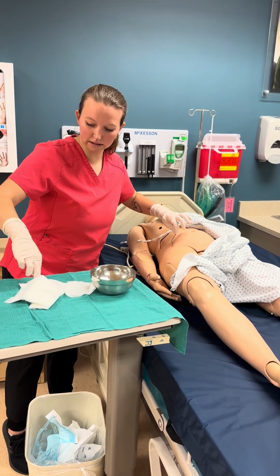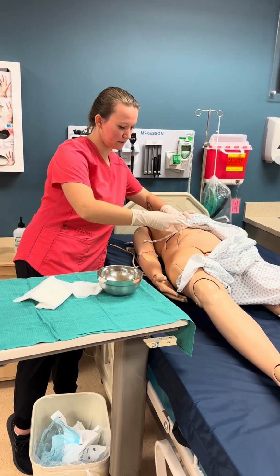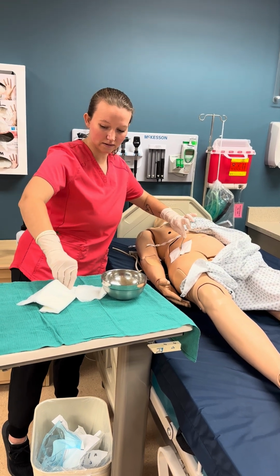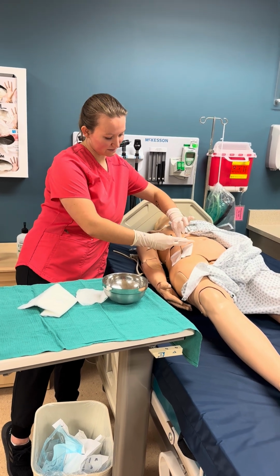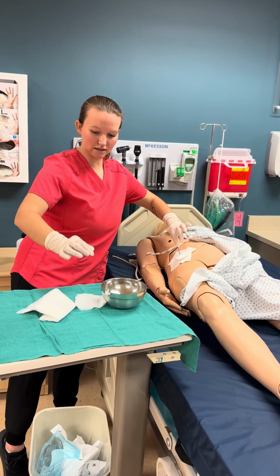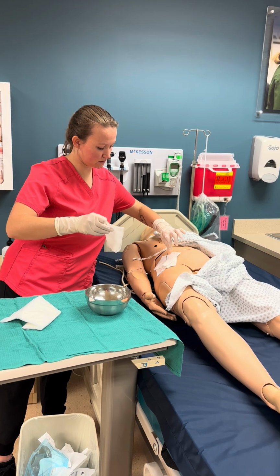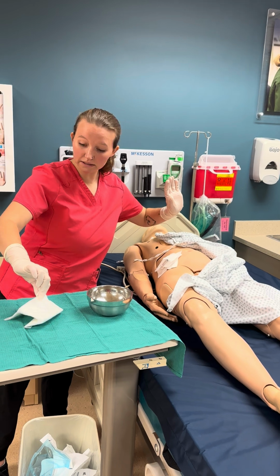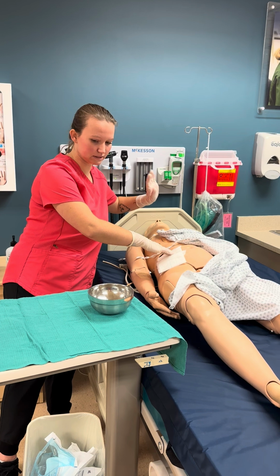And grab my splits here. And then Pac-Man them. And just nicely put them on without touching anything. Gonna grab my other one nicely. Put it on without touching anything. The opposite direction. Good, and then I can grab my gauze here. I can put the tubing down, put my gauze over top. I can grab my ABD pad, put this over top. Okay, and now the sterile is done.